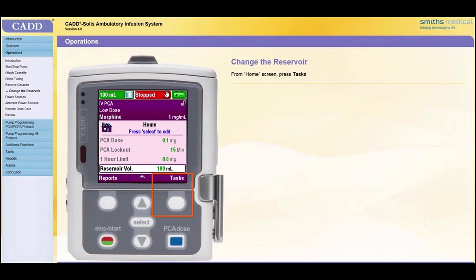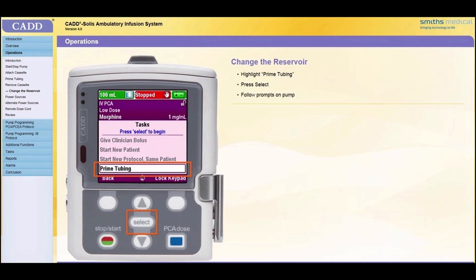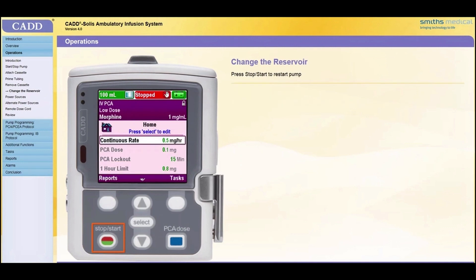If it is necessary to prime the tubing after a bag change and before restarting the pump, follow these steps. From the Home screen, press Tasks. Scroll down to highlight Prime Tubing and press Select. Prime Tubing as outlined earlier in this operations module of the training. Note: if the keypad is locked, enter the security code when prompted. Press the Stop Start key to restart the pump.